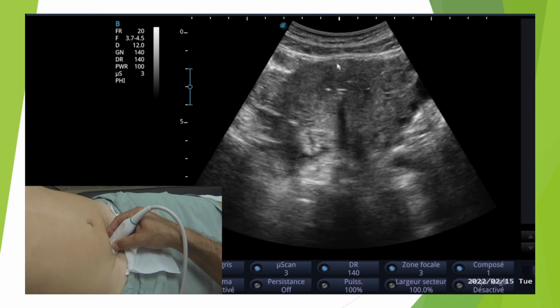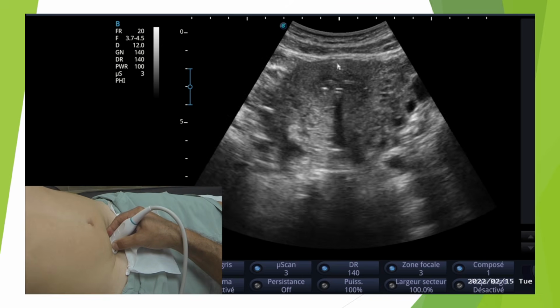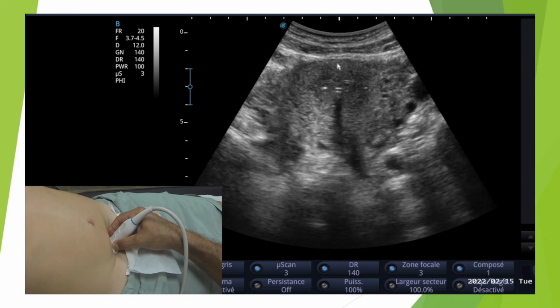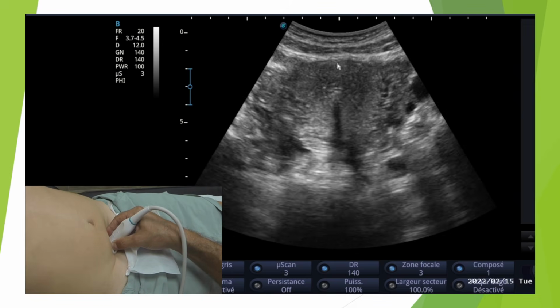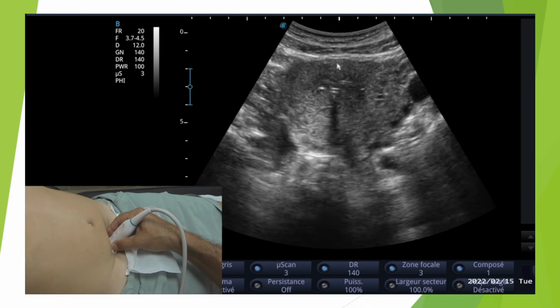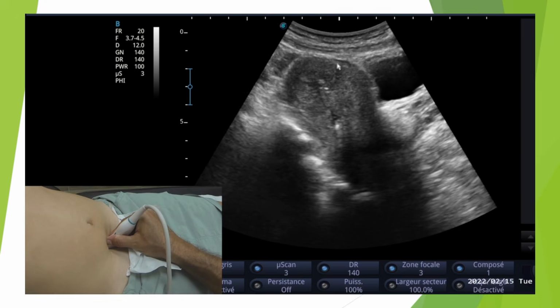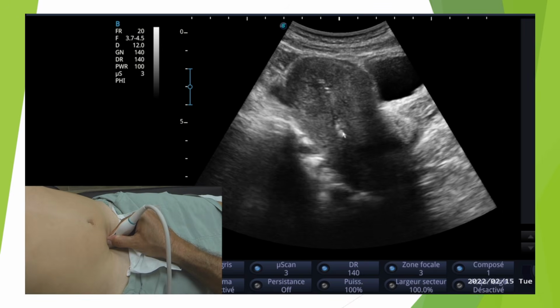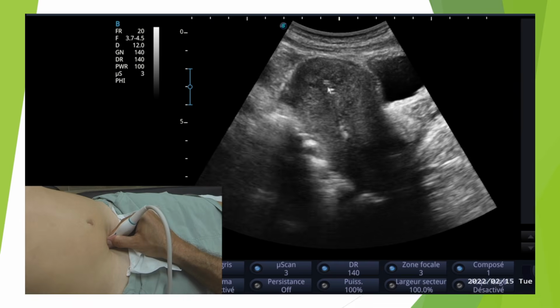Of course, it will depend on the patient, whether the patient is echogenic or not very echogenic. It will also depend on the position of the uterus. Is the uterus more anteverted, anteflexed, or retroverted, retroflexed? That can change things just a little bit. But as you can see here, overall, it's not necessarily something very difficult, especially since all you have to do is take, so I'll repeat, a measurement in the sagittal plane. So here you can see the upper end of our IUD, here the lower end of our IUD. It's in the lengthwise position, so it's located like this.